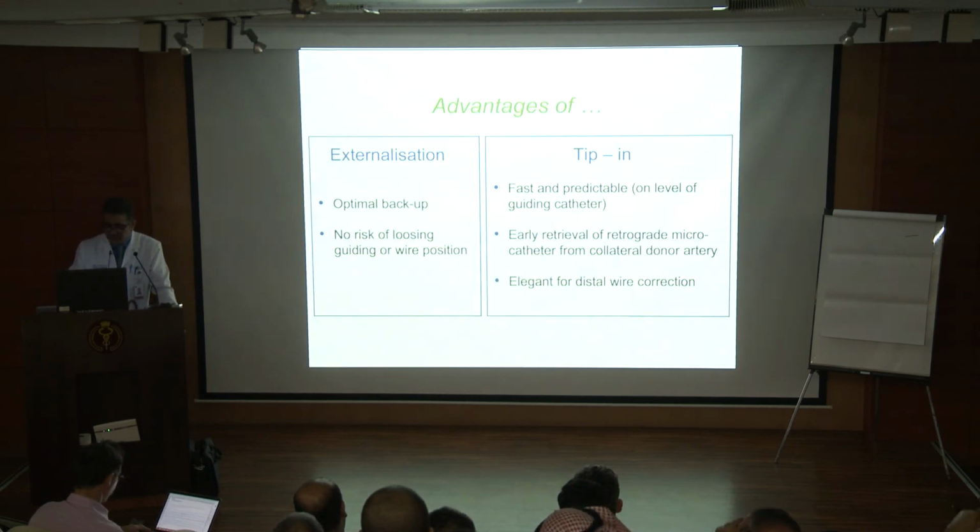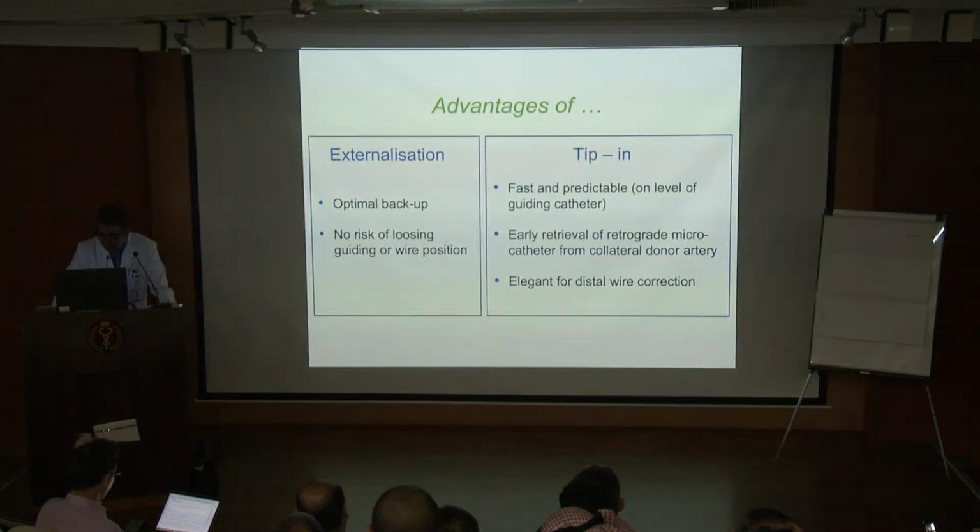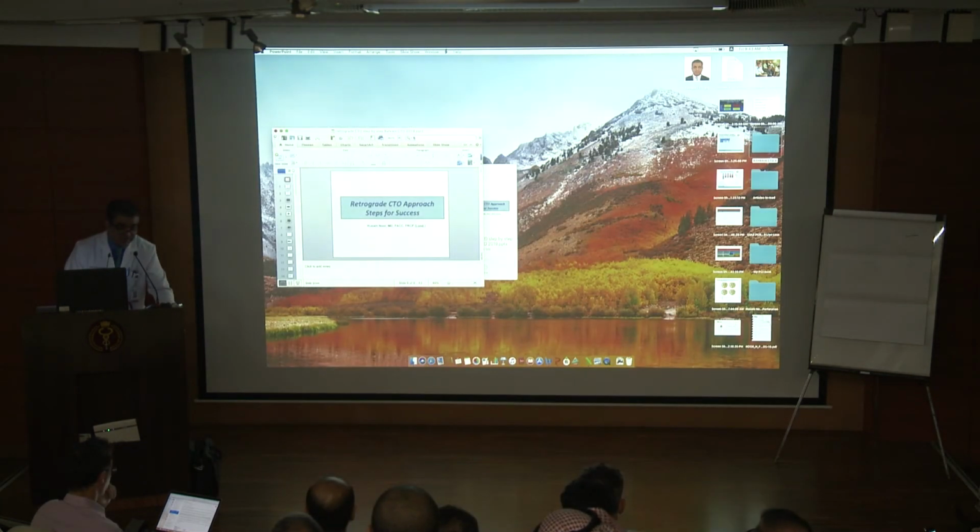There are advantages of that. It is fast, predictable. You can easily retrieve the retrograde microcatheter from the collateral, elegant for distal wire correction. However, the externalization gives you an excellent backup. With this, I think I'll stop. If you have any questions, I'll be happy to take them.